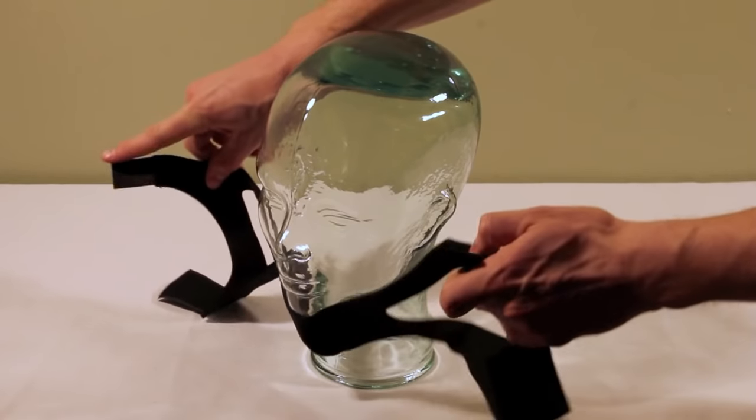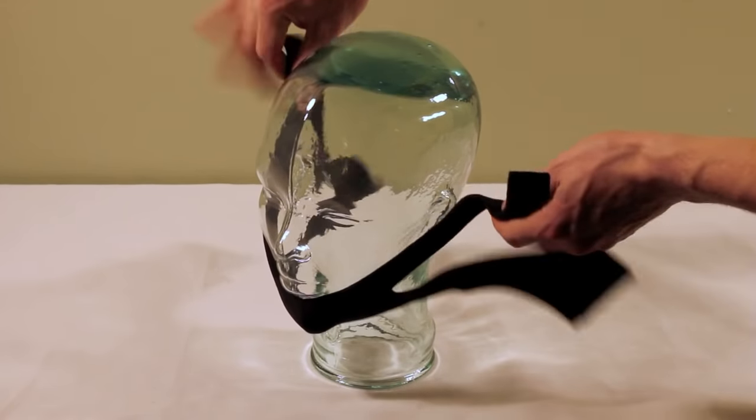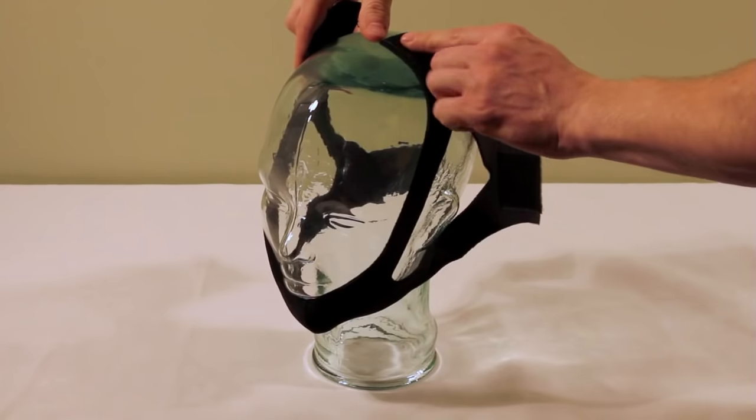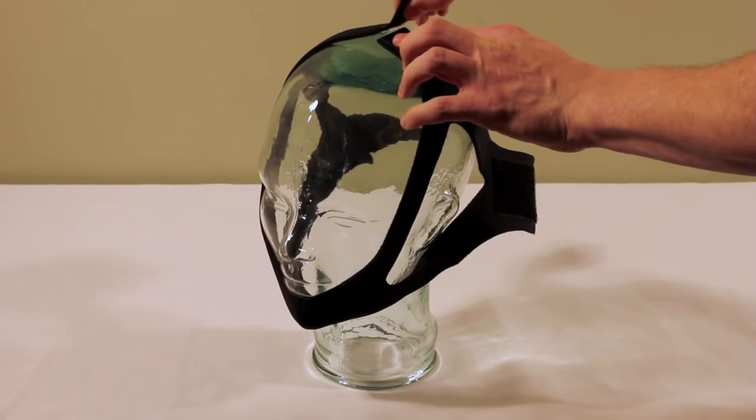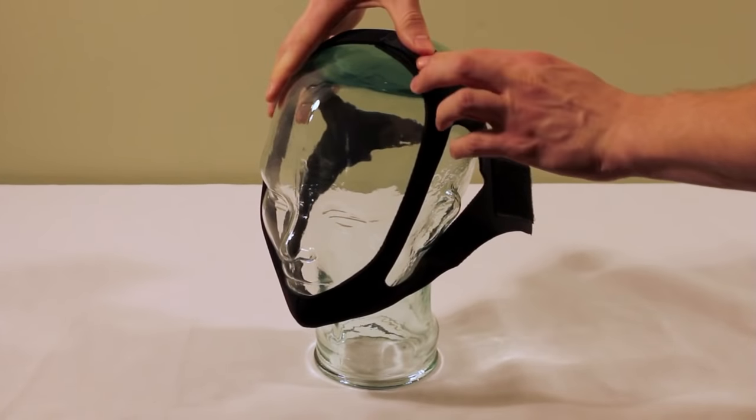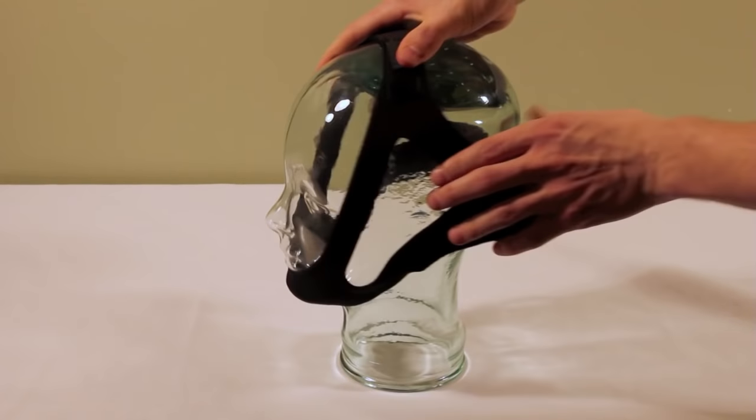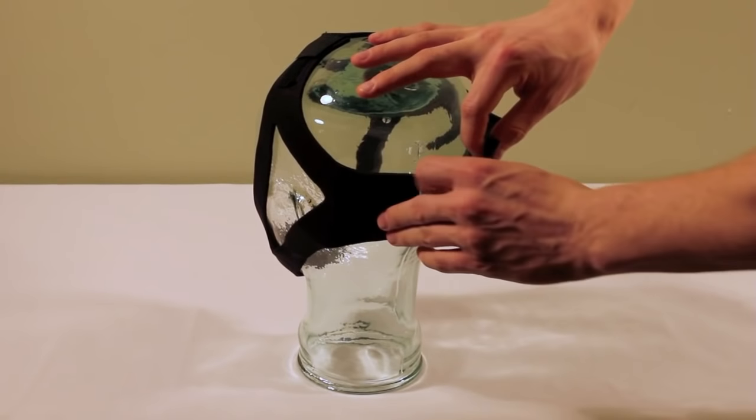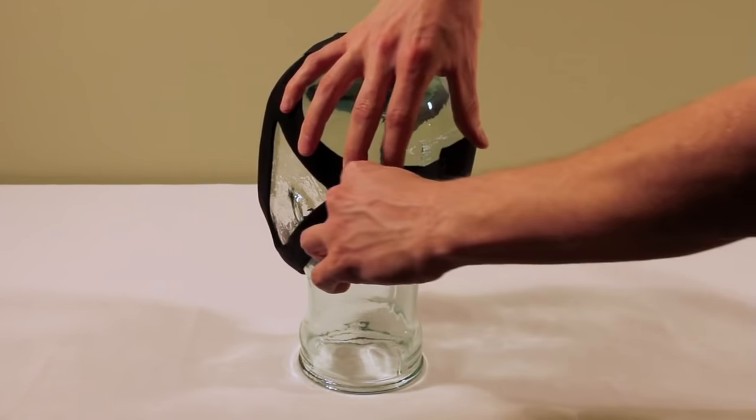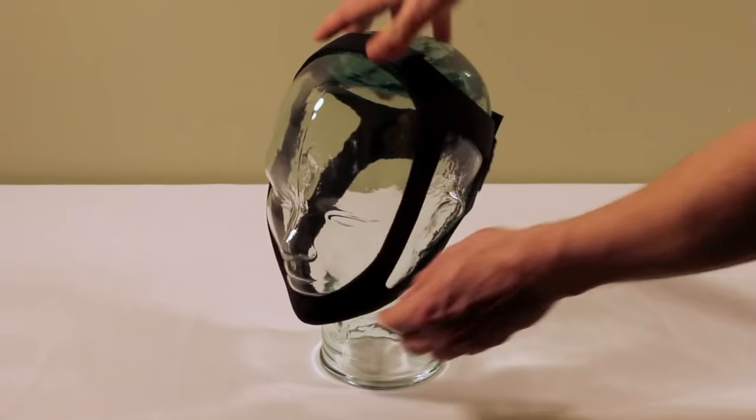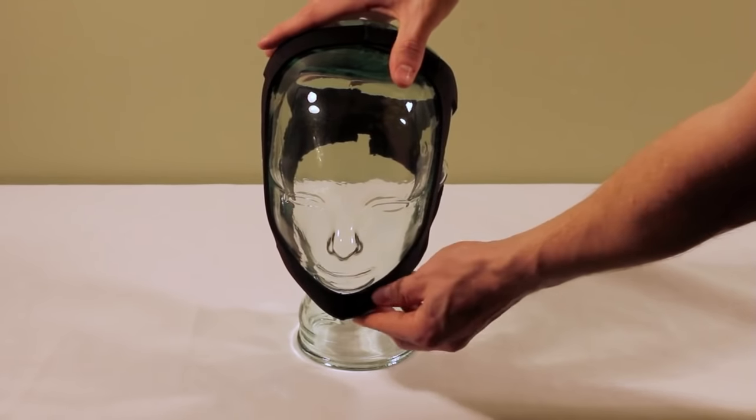You are then going to put the curved portion around the patient's chin and velcro the thin straps on the top of the head first, then moving back and velcroing the thicker straps in the back of the head and make sure that the chin is secure.